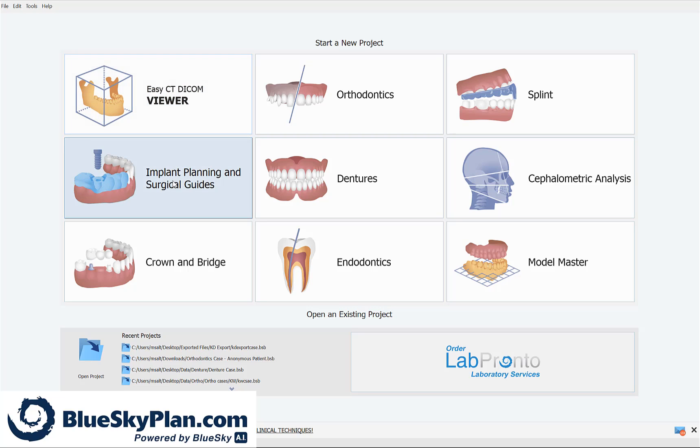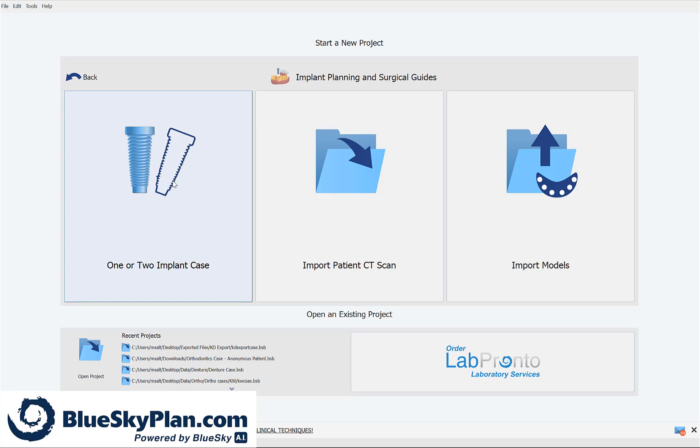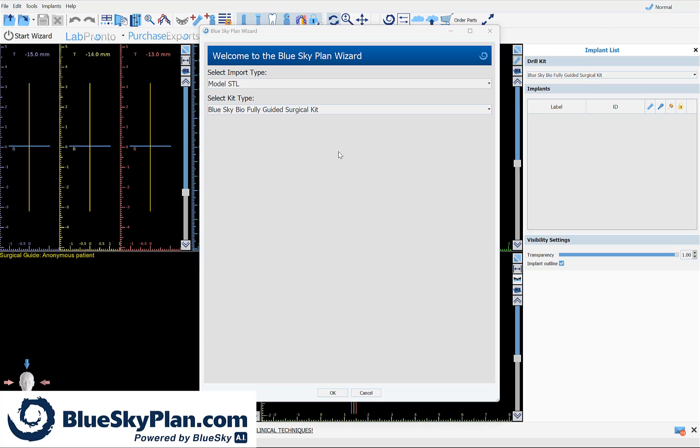We're going to start by clicking on implant planning and surgical guides and selecting the option for one or two implant case. The welcome screen prompts you to select the import type and the kit type.